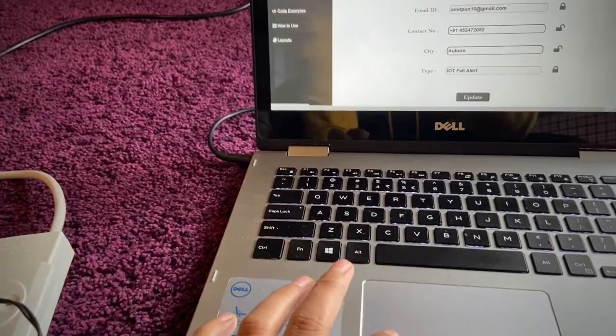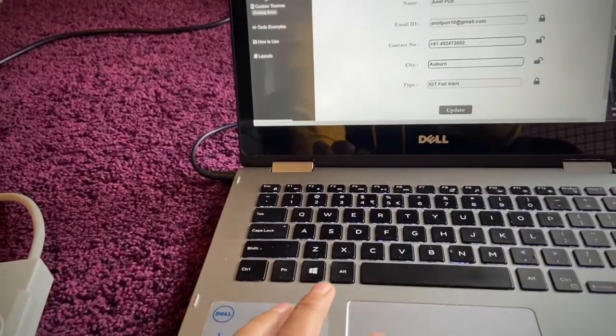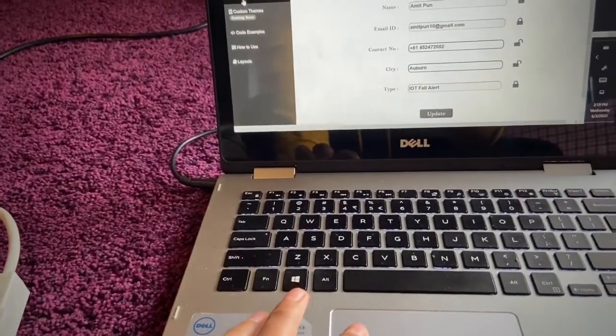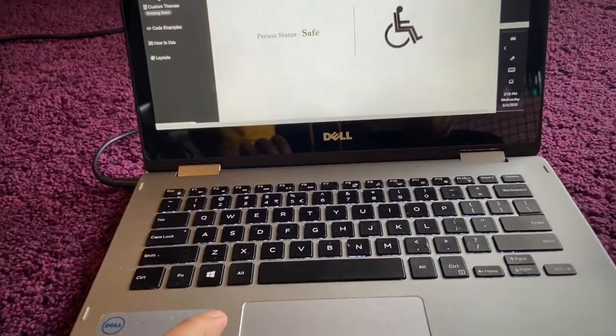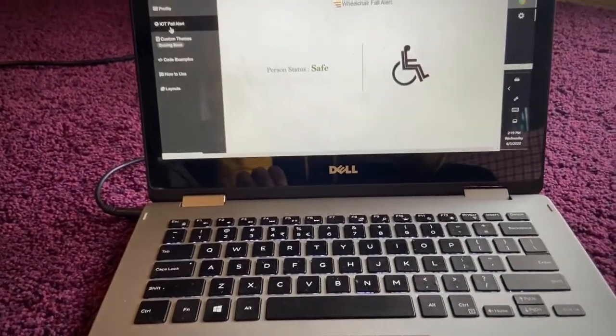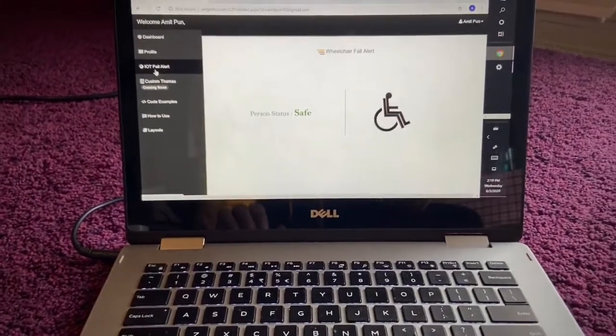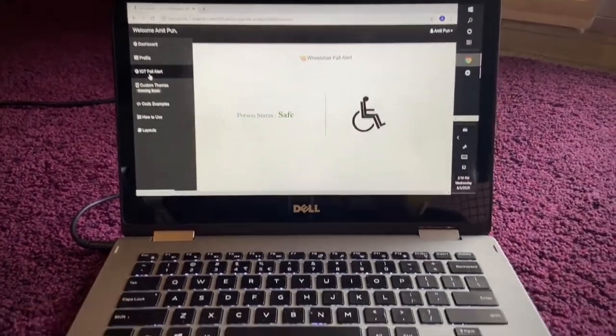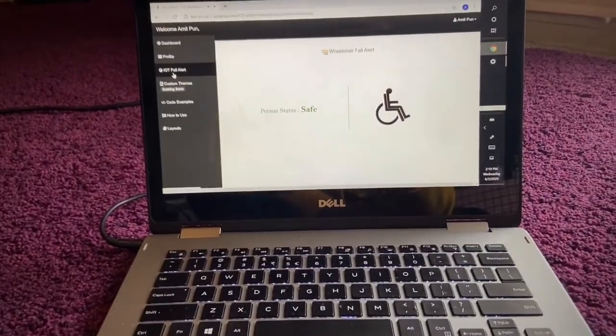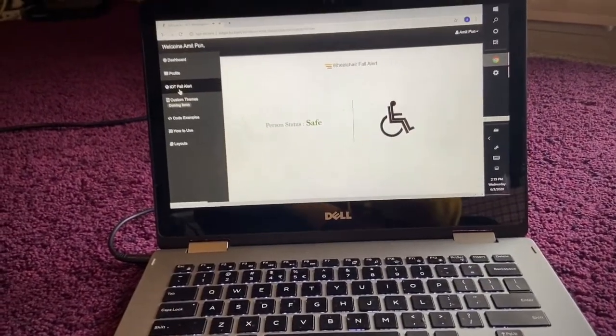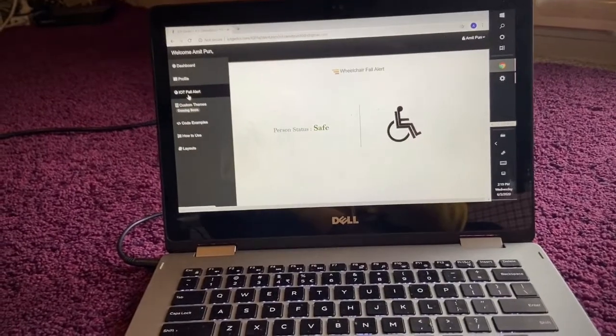So you can see how it looks like while monitoring this device.